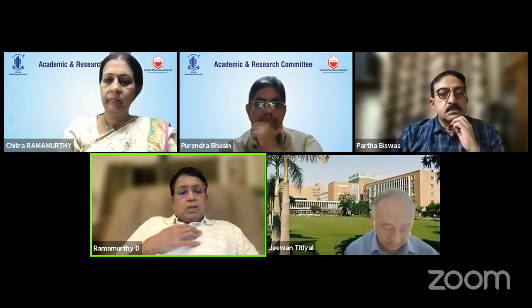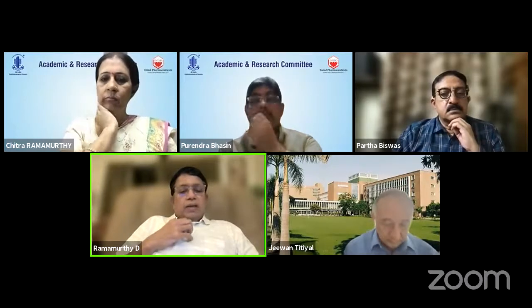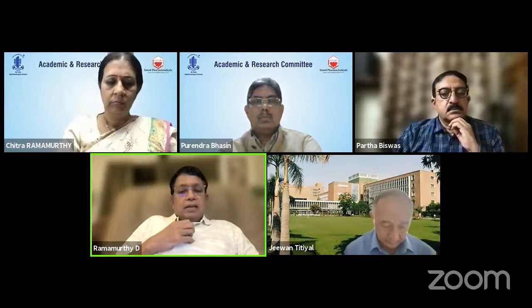So for a patient who repeatedly keeps asking whether the correction that you are going to do is going to be absolutely fine, I tend to shift more towards phakic intraocular lenses, because it's like putting perfect glasses inside and it serves the patient very well till they become presbyopic.